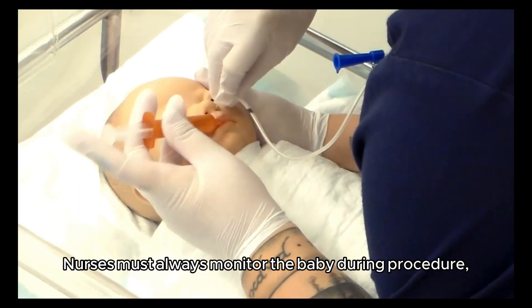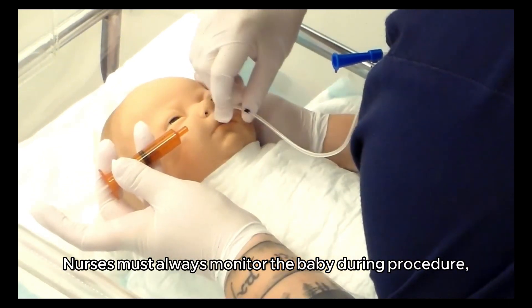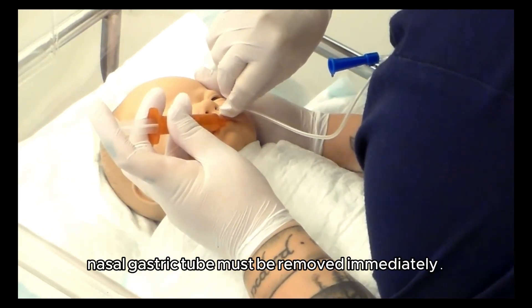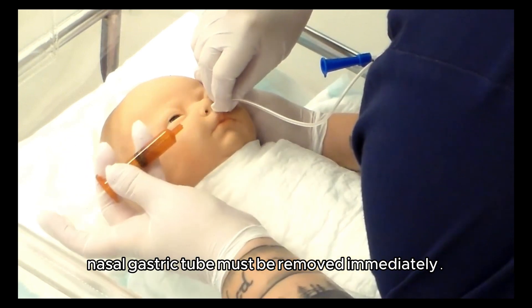Nurses must always monitor the baby during the procedure. If breathing gets difficult or the baby's color turns blue, the nasogastric tube must be removed immediately.